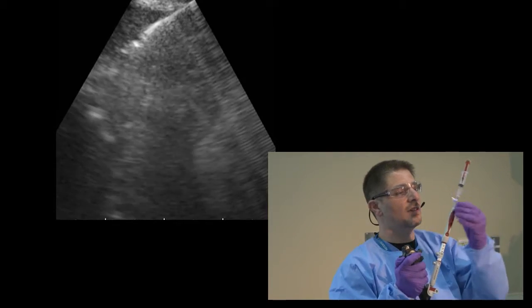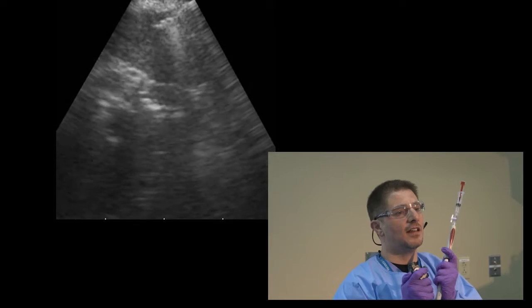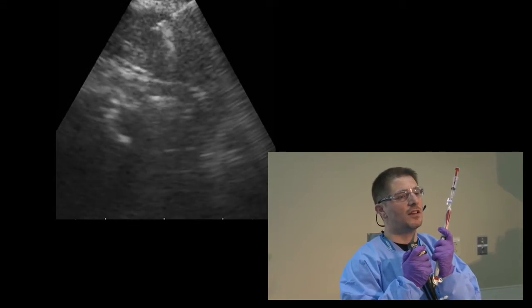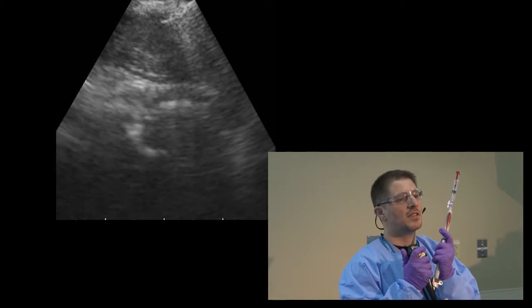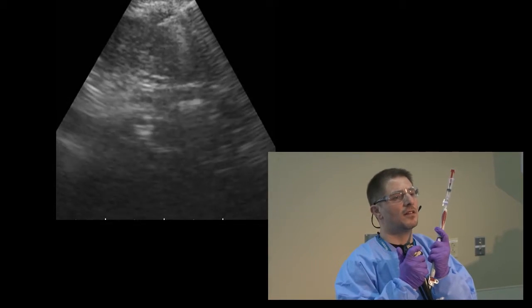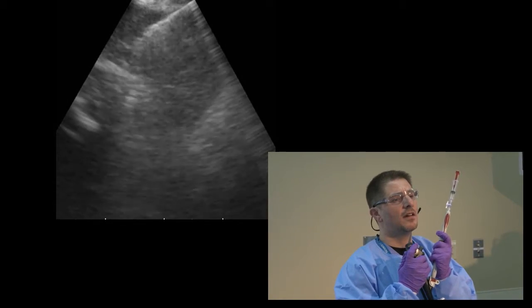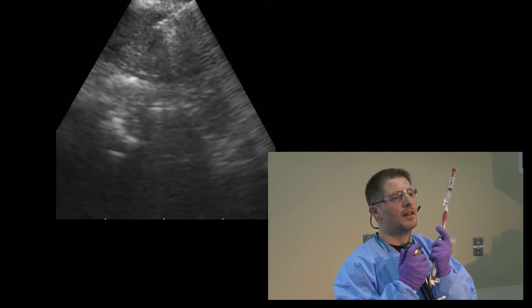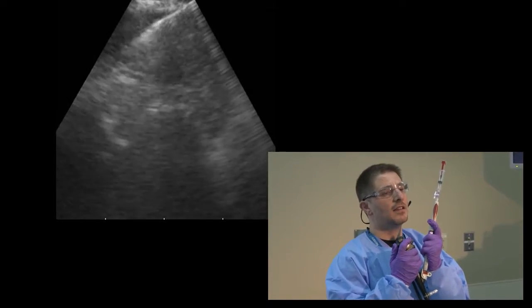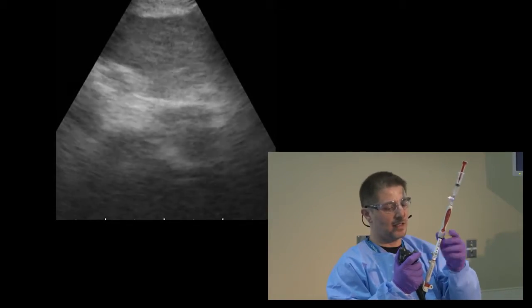Since this lymph node is large enough, we're going to do a fan technique, which is trying to get multiple samples from different locations of the lymph node. You go back to the proximal part, you change your thumb, and you sample a different area. You go back to the proximal part, you thumb down maximum, and you sample one more area. And then you go back to the proximal part, and then neutral, and you sample a different area. Like this, you try to get multiple samples from the same lymph node.